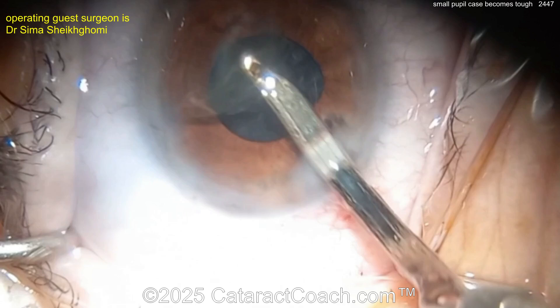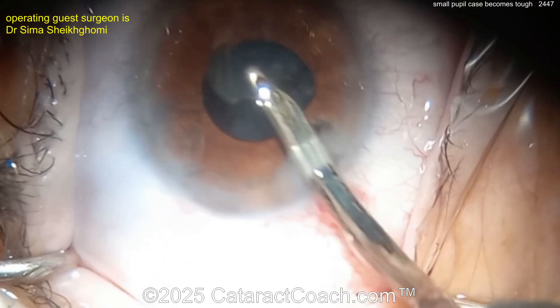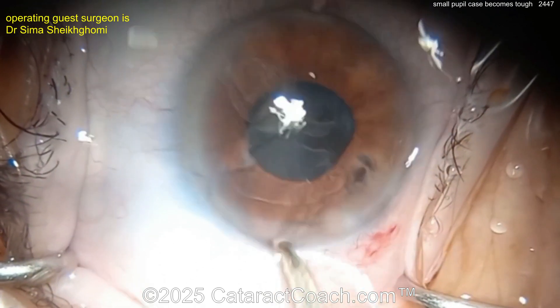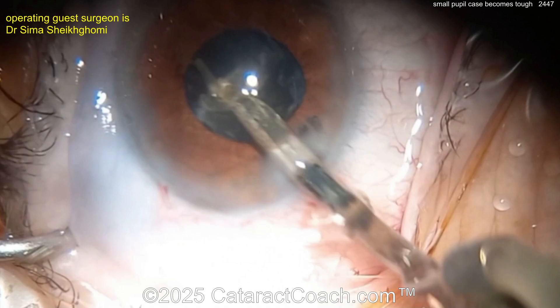You can see there's already some sub-incisional iris damage — not under the phaco incision, but underneath the paracentesis incision. The paracentesis was just too big; the chopper kept prolapsing through it, and now that iris has gotten damaged.